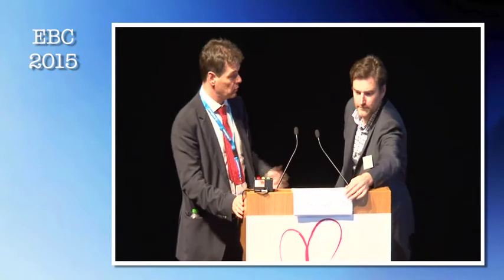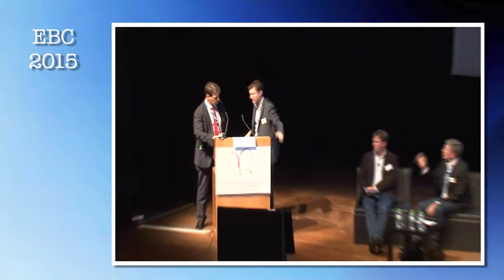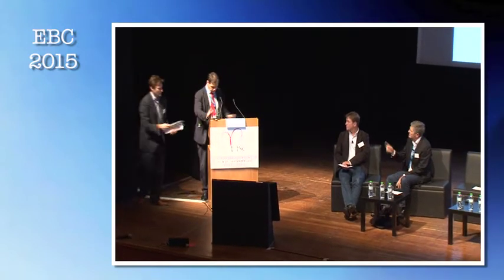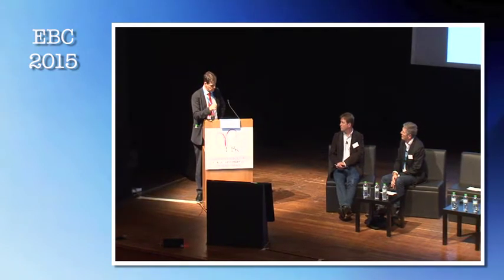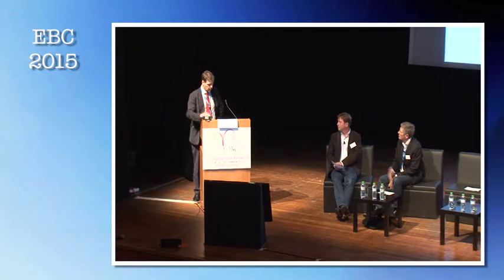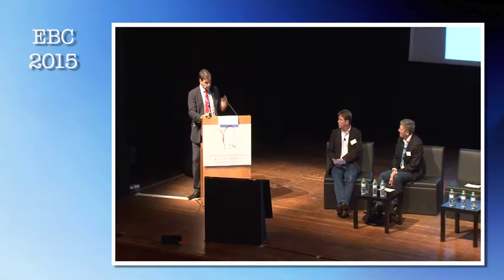Thank you very much, Robert. Just one short question about the duration of inflation. Did you test different durations, or did you test several inflations in the same vessel? Because we learned from Japanese people that there is a big difference. So what was the protocol? No, the protocol was that it was going to be at 37 degrees, and we kept the balloon inflated for 30 seconds.